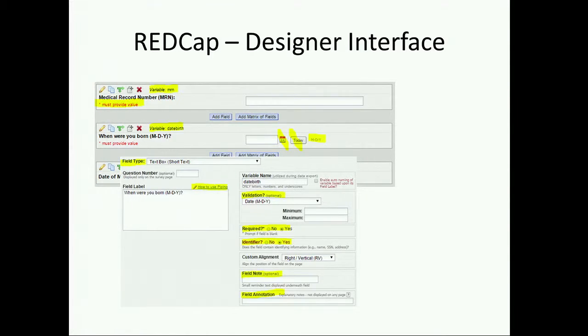And they have routines so that when the data get exported, it gets anonymized automatically inside the software. And so they have checks in there anticipating HIPAA issues, anticipating privacy issues. And so it spares a lot of the grief of having to design it for each and every instrument as you do inside your own project.